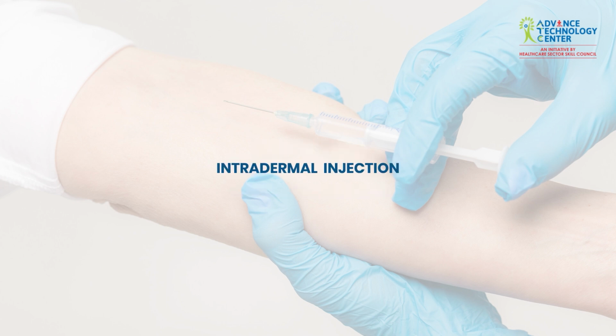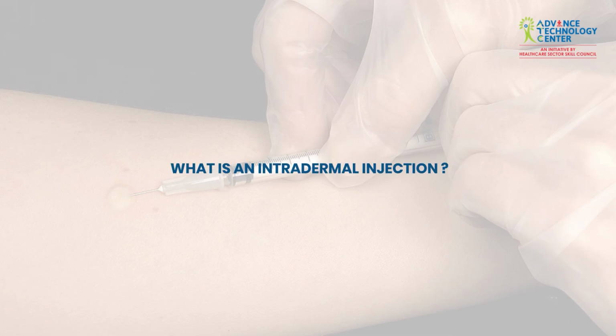In this video, we'll demonstrate the correct technique for administering an intradermal injection. What is an intradermal injection? An intradermal injection involves administering a small amount of medication into the dermal layer, just beneath the skin's surface. It is typically used for sensitivity testing, tuberculin screening, and administering select vaccines or local anesthetics.